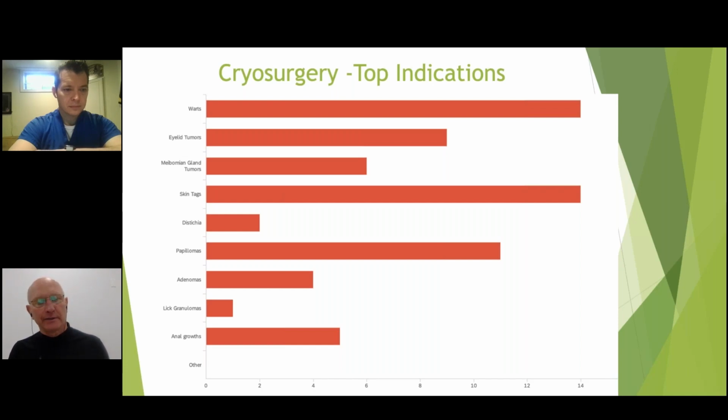And this is an alternative to a pharmacological approach or some other herbal medicine, as an example, to dissuade licking there. And the idea is that cryosurgery numbs the area, and so the patient stops going after it because they don't sense it anymore, and it gives a chance for then a healing process to take place. That's been really successful, and we're starting to see that noted more and more as kind of a go-to in terms of cryosurgery and being able to go after difficult cases.